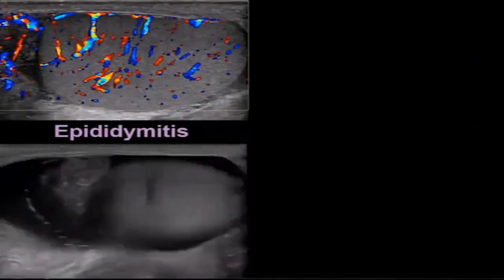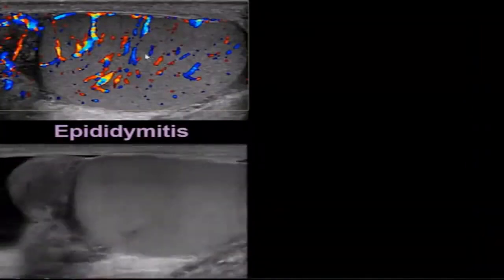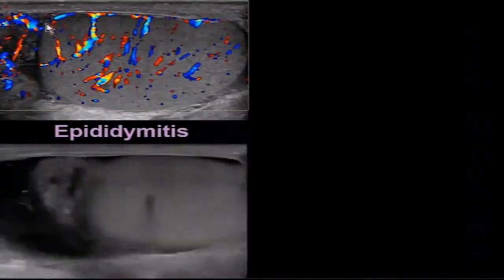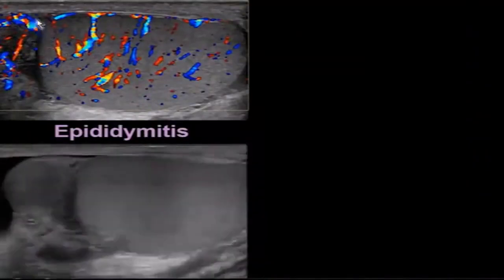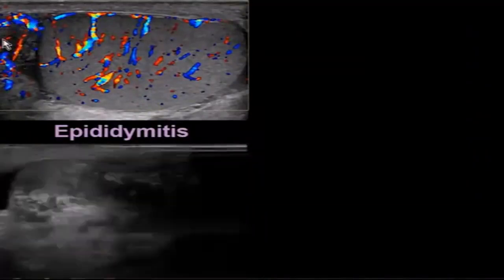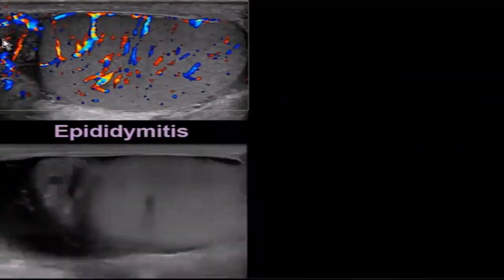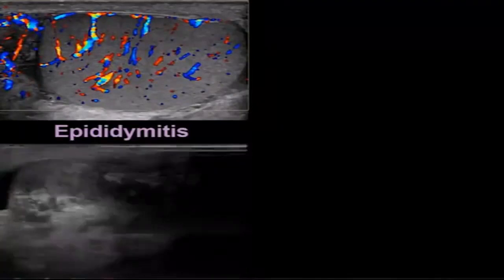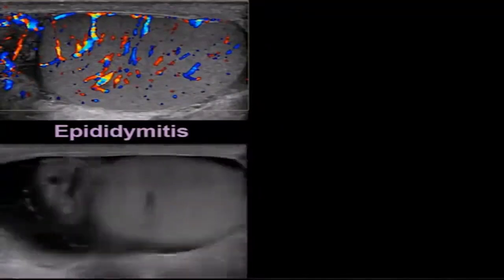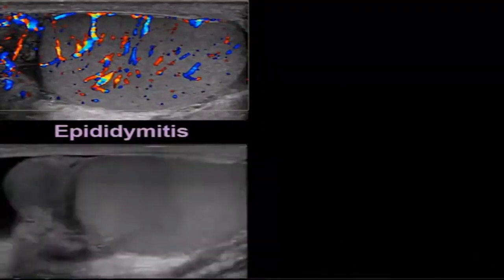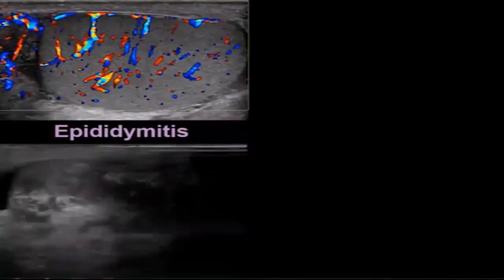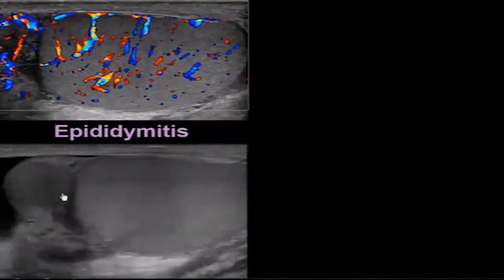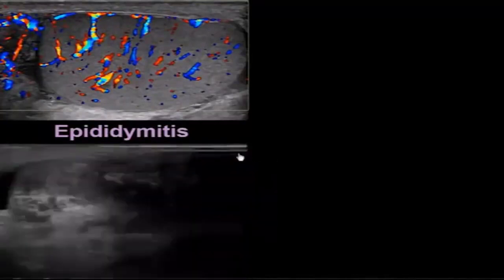Here's a patient with epididymitis. You can see the epididymis sits above the superior pole of the testicle and has a lot of blood flow. Normally we do not see much blood flow in the epididymis, but when it becomes inflamed with epididymitis, the blood flow increases. On this clip, we can see thickening of the epididymis as well as a hydrocele.